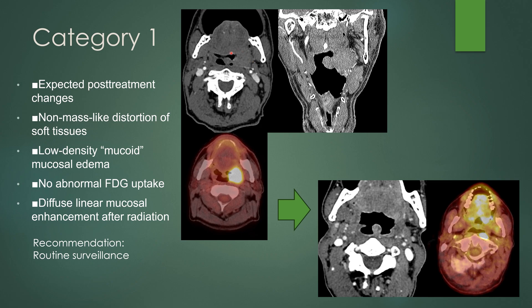This patient had a left oropharyngeal cancer at that palatine tonsil. You can see a mass involving the tonsil with activity on FDG PET. Post-treatment on the CT scan, we see some distortion of the normal architecture but no mass-like appearance. On the PET scan, in the area of the cancer at that left tonsil, there is no abnormal uptake. This would be a Category 1 — routine surveillance.